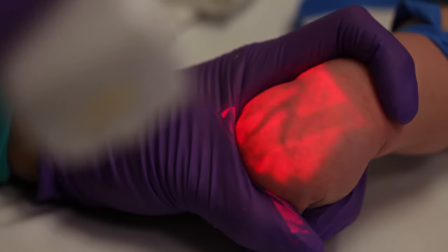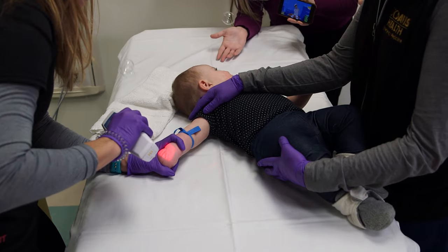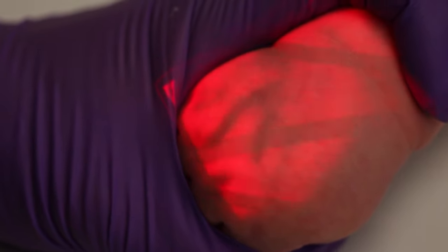A vein illuminator can also be a helpful tool if you have access to one. It provides a map of the peripheral veins and can make it much easier to locate hard-to-find veins.